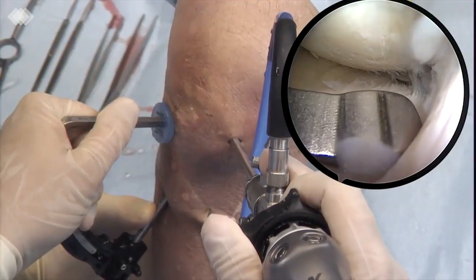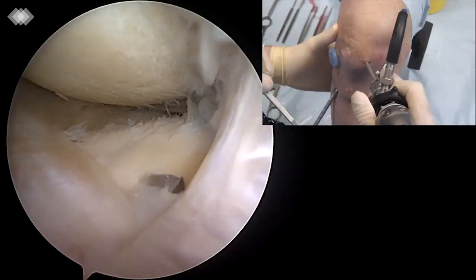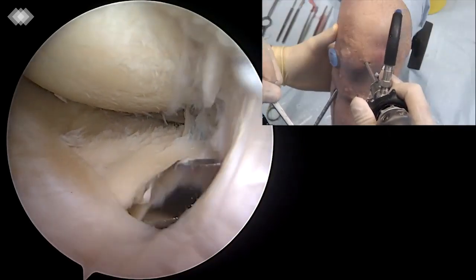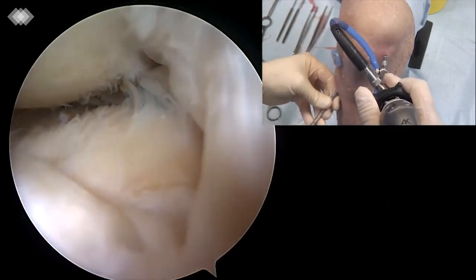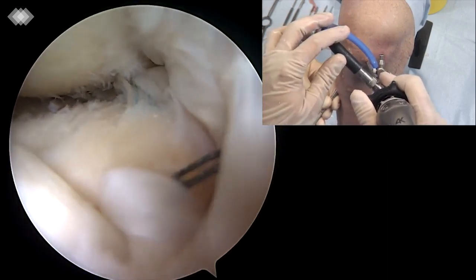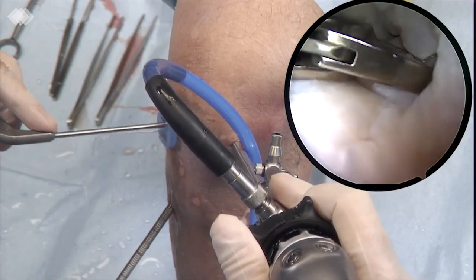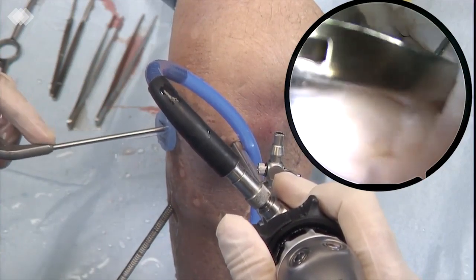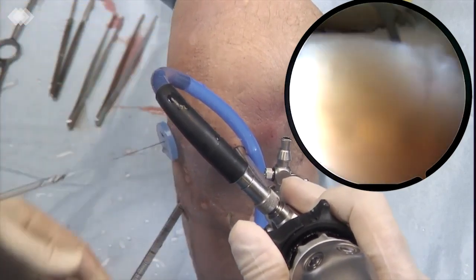An anterior tunnel is performed with the same technique as the posterior tunnel. The tunnel is drilled starting from the anterior-medial cortex of the tibia. The meniscal root mark and hook is used to guide the 6mm tunnel made with the flip cutter. The exit point on the articular surface of the tibia is located 1cm posteriorly to the meniscus anterior horn attachment.